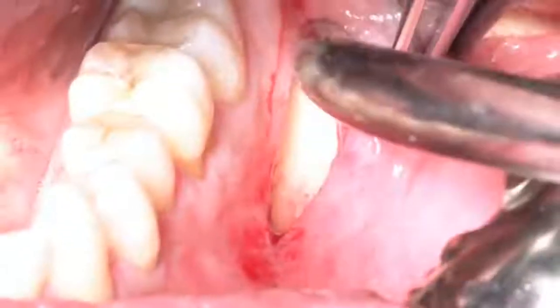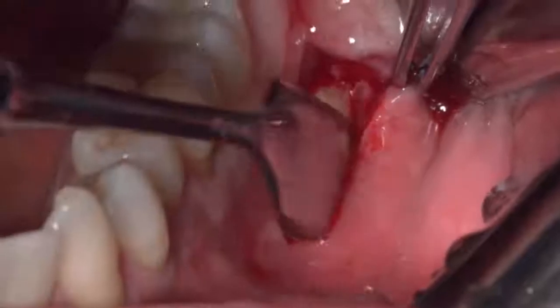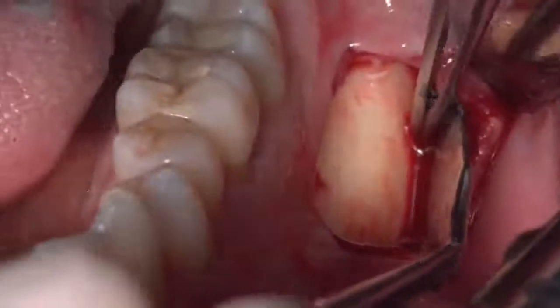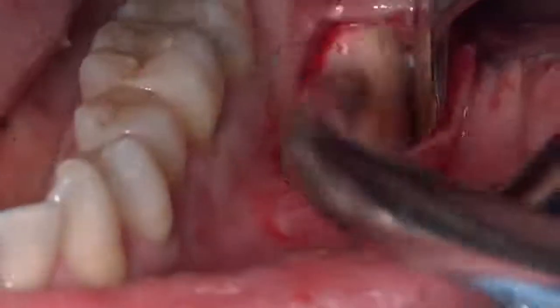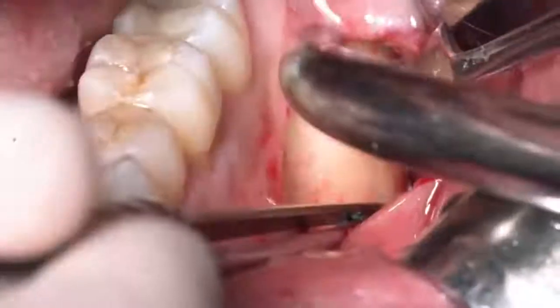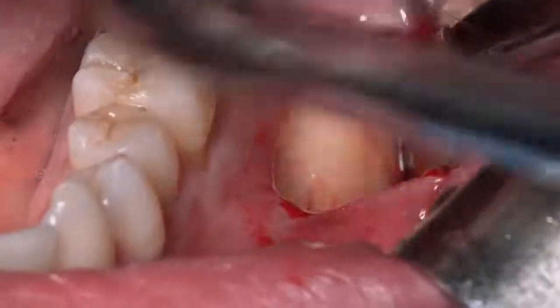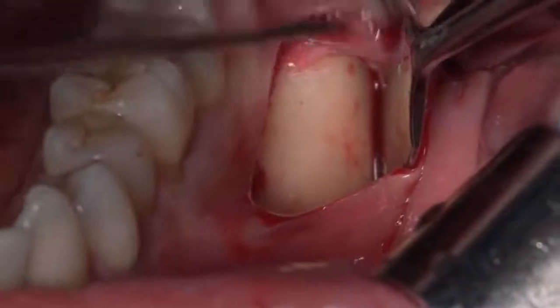Then we look for the periosteum and cut only the periosteum distally — not the muscle, but first the mucous membrane and then the periosteum. At this point the muscle can be dissected by blunt dissection, while the periosteum and the mucous membrane have been cut, so you can elevate your flap as needed.